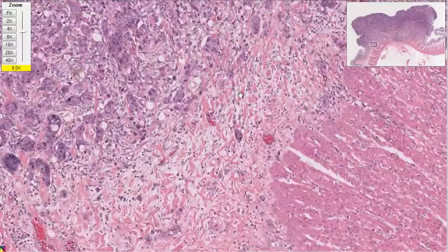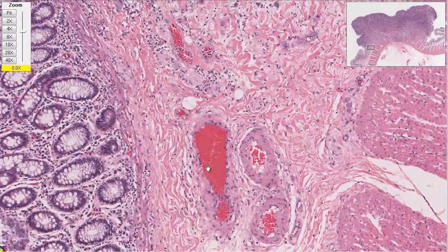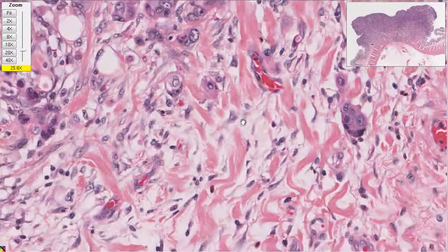But here's the problem. Remember how I said up here it's not a big deal? Once you get down near the veins and arteries, these guys are running amok. You can actually see these cells have split off and are infiltrating. So you can see these guys here. That's one little nest of cells. There's one that's probably a cancer cell just dying to get into that little vein.